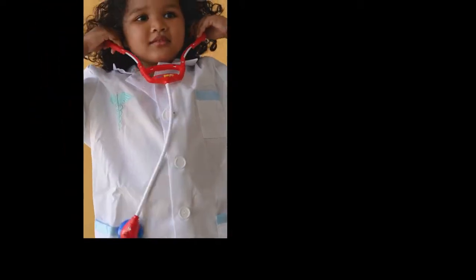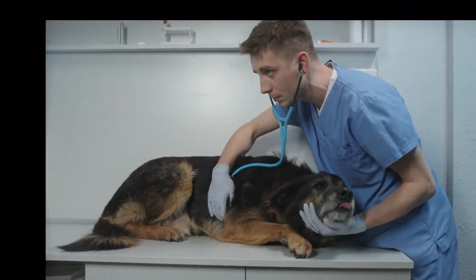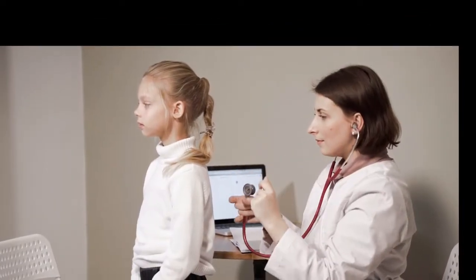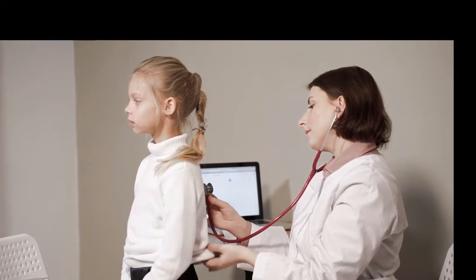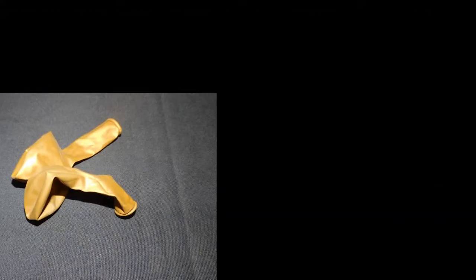But before we start, let's just tell you something about this experiment. In this experiment, we will show you how to make a stethoscope. A stethoscope is a medical device that is used for listening to internal sounds of an animal or a human body. It typically has a disc-shaped end that is placed against the skin and one or two tubes connected to two earpieces.